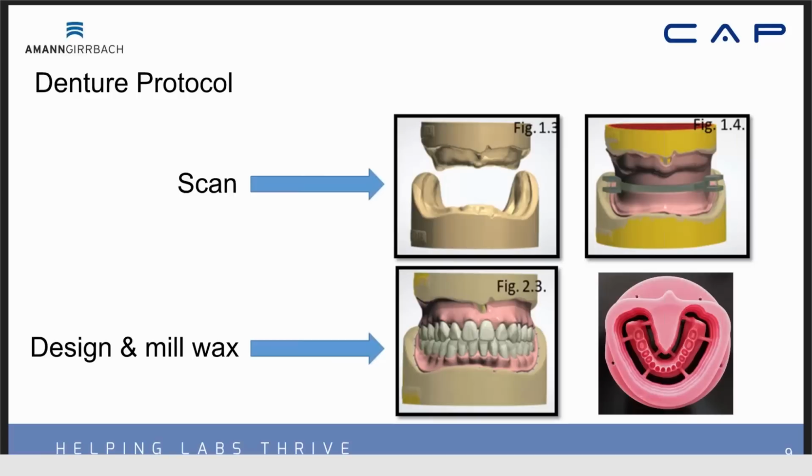He'll get his initial impression, custom trays, final impressions, final models, base plates and bite rims, and he'll do that try-in of the base plates and bite rims, get the proper vertical, get landmark areas, some midlines and cuspids, things of that nature, get the length of the bite rim to where he wants his incisors placed.